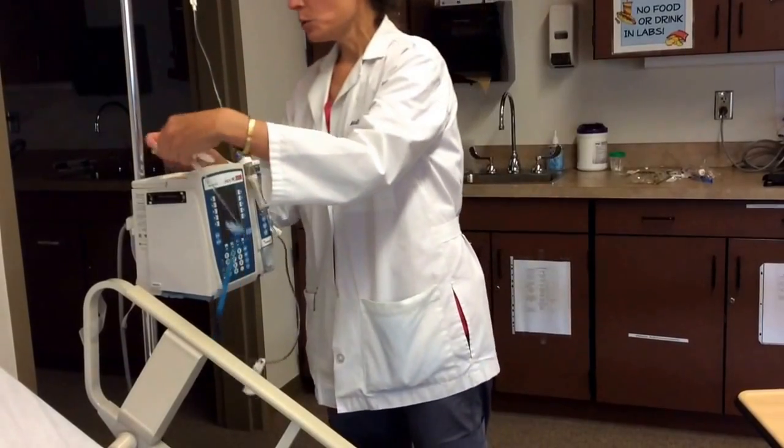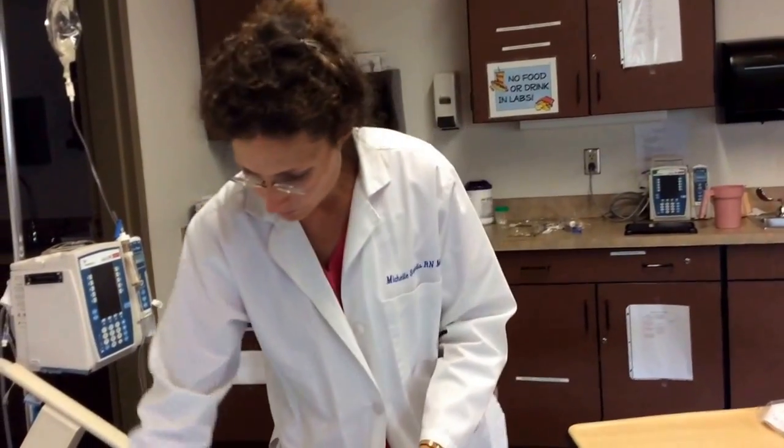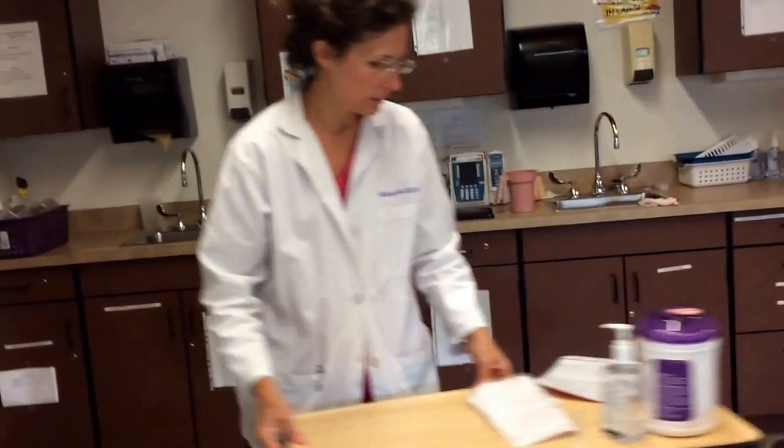I am going to leave this tubing ready now, and I'm going to get the blood from the lab. So I'll be back in a few minutes, Mr. Smith, and when I return, I'll have another nurse with me, and we'll do some verification of the blood, and then we'll get that started for you.